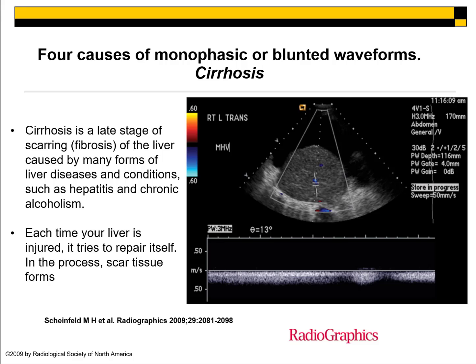As you can see in this image here, there's a lot of fluid. So all this anechoic area here on the ultrasound, that's massive ascites. So we have all that fluid there, and you can see this smaller liver here that they're sampling to find very compressed and tiny hepatic veins that you can probably barely even see yourselves, right? So it's compressed here.